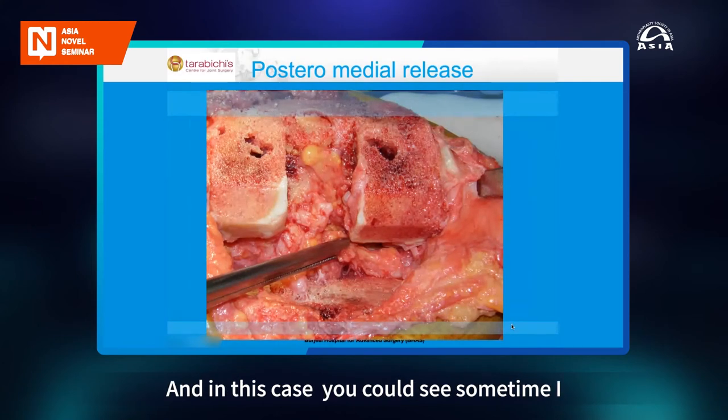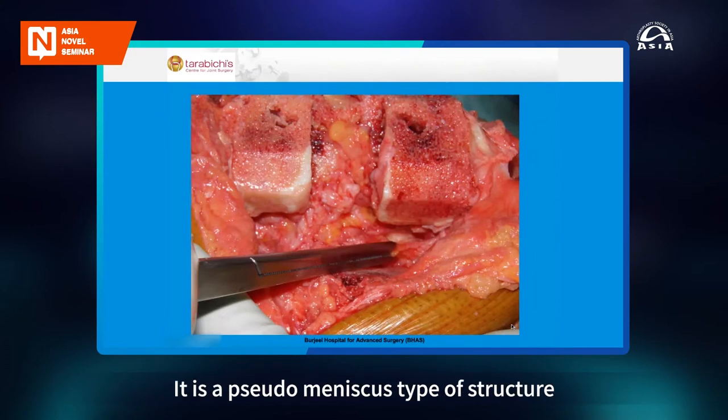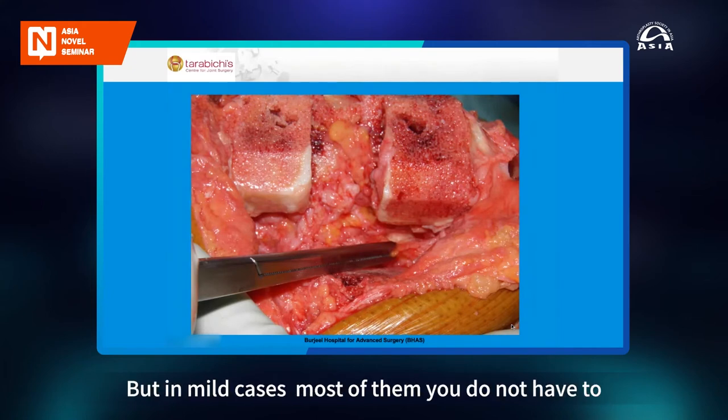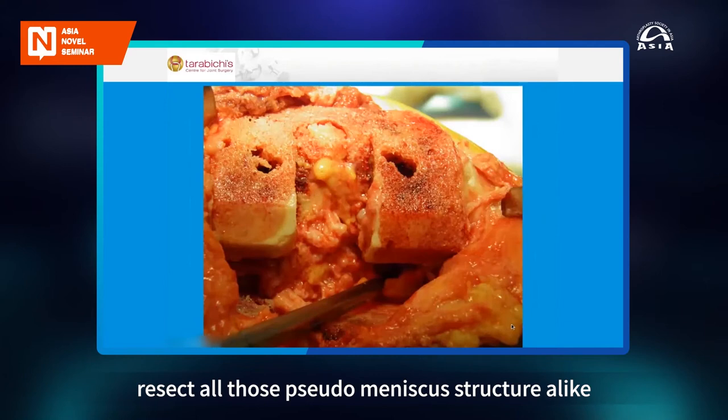And in this case, you could see sometimes in mild cases like here, I cut down to the capsule and I don't excise the capsule, but I cut down to the capsule. It's a pseudo-meniscus type of structure you will keep encountering, which is a scar tissue because of the flexion contracture. But in mild cases, most of them, you don't have to penetrate the capsule. But remember, resect all those pseudo-meniscus structures.